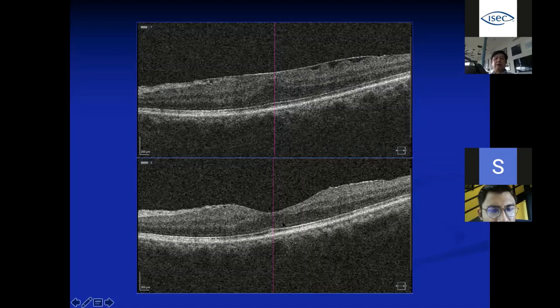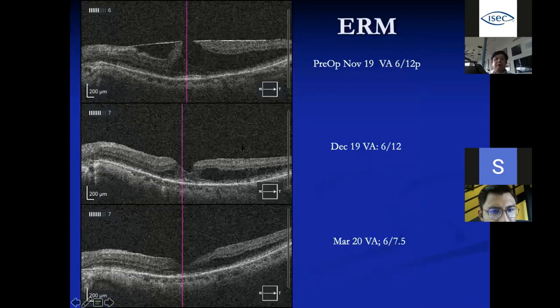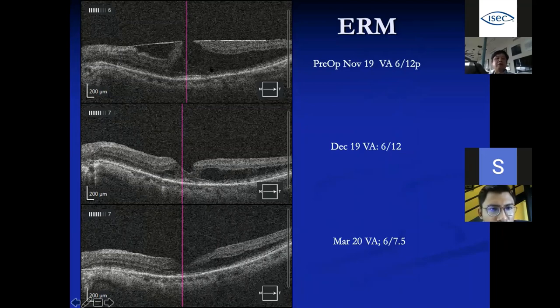Always look for whether there is a breach in the RPE layer. If not, it is not macular degeneration. Before and after operation, the swelling and distortion resolve. Another ERM case: the retina is being split apart but there is no full-thickness break. After removal, the retina restores itself — vision improved from 6/12 to good vision. The key message is: some ophthalmologists have treated ERM as AMD, giving multiple injections to no avail, resulting in lost time for proper treatment.